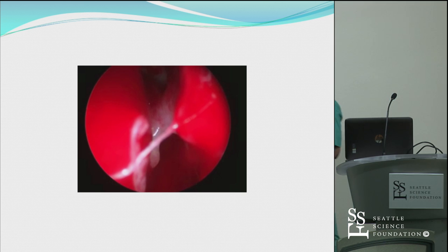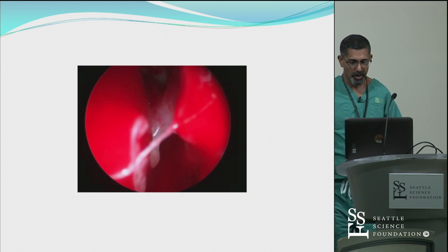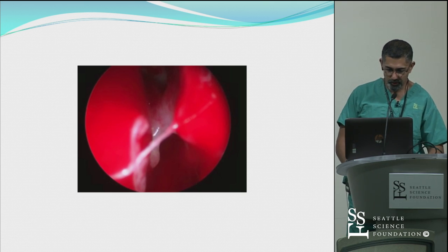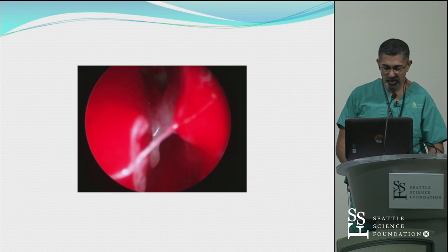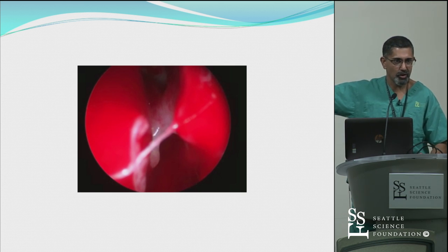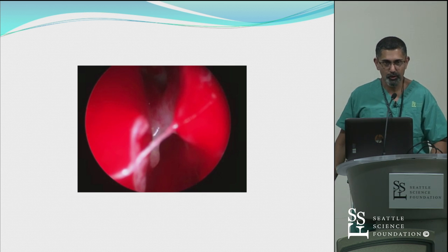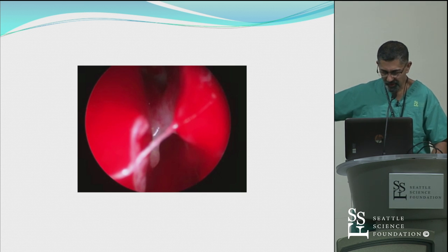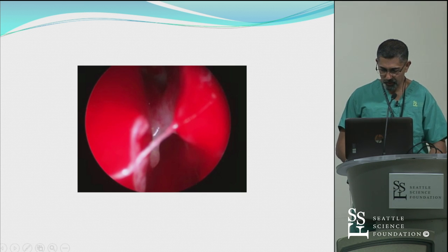You can see this partition was left between the anterior part of the supraorbital ethmoid air cell and the frontal proper, which is going to be more anterior and medial. If you're in the operating room and feel like you can take that down without stripping mucosa out of the recess, that's another perfectly legitimate maneuver after you've done this with a balloon — or you can leave it there, depending on your discretion.